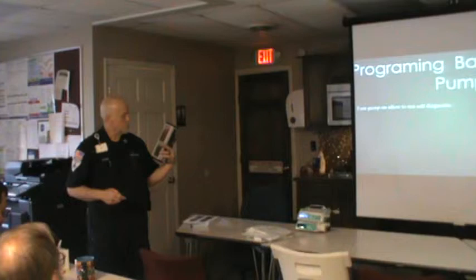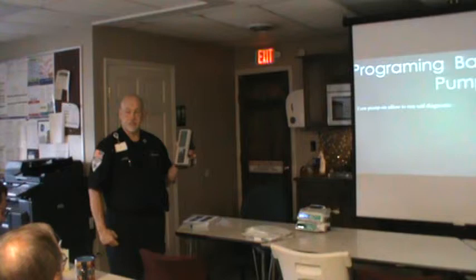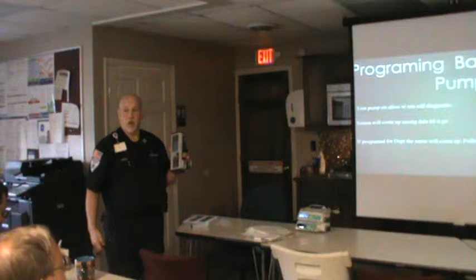Now it comes up and it says 'date invalid' — I don't worry about that. This pump had belonged to the NICU, so 'NICU' comes up. We have some that say NICU, some that just say 'none,' and some that say 'life flight.'